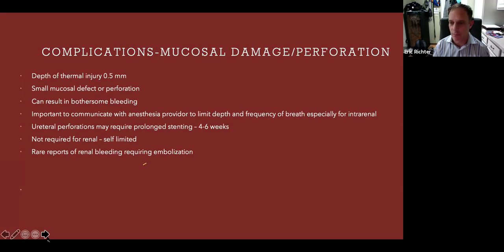I do think for intrarenal stones, that little bit of movement can make a big difference. It can be very dramatic intraoperatively. And that's where you can be lasering, and then all of a sudden the patient breathes, the kidney moves, and then your fiber goes right into the epithelium and then you can get bleeding.